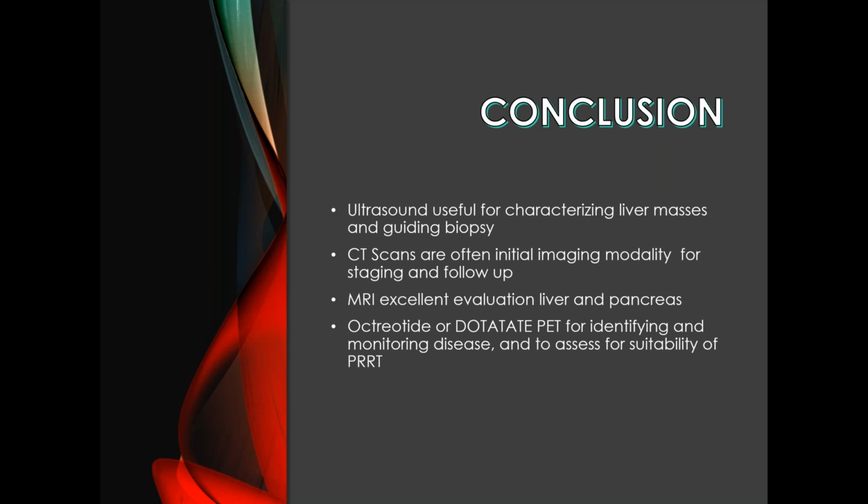We found that it's not as useful as we thought. It's useful if the patient has not a lot of fat in their mesentery, and then all the bowel is collapsed on itself, and you can't see if there's a lymph node or a tumor because everything's collapsed on itself. But most of us have a little bit of fat to separate out the bowel, so it's not usually an issue.